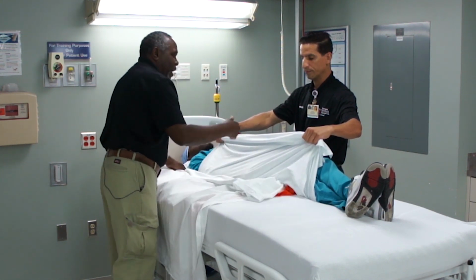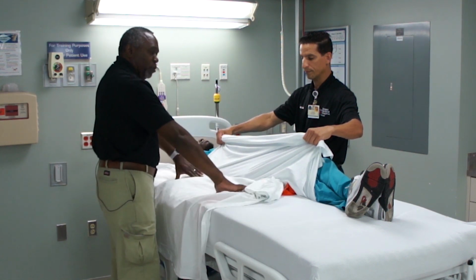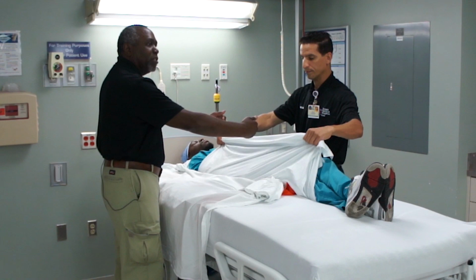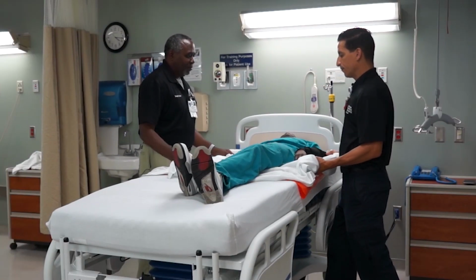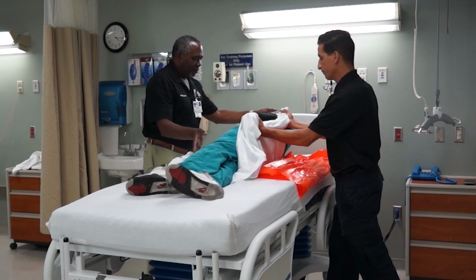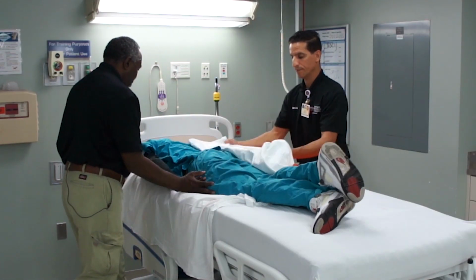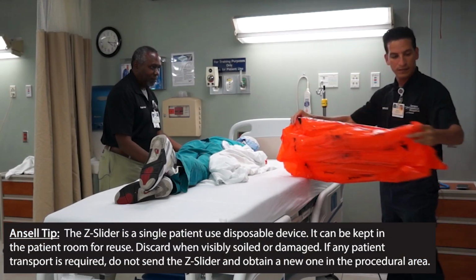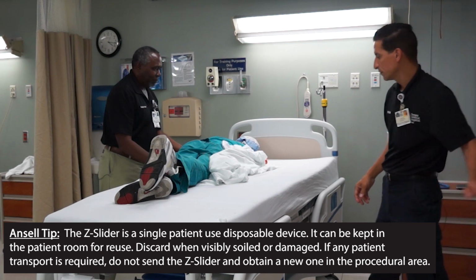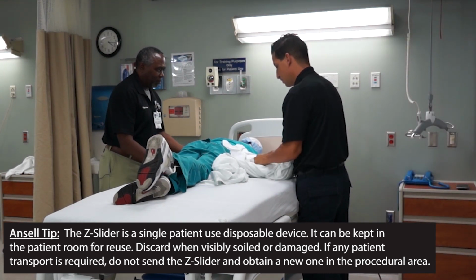Once Hector has completed the pronation, then we'll be able to use the new Z slider and draw sheet to get the patient properly centered on the surface. Okay. Alrighty, got his arm. Excellent. I'm going to remove the old Z slider. I'm going to remove the old draw sheet.